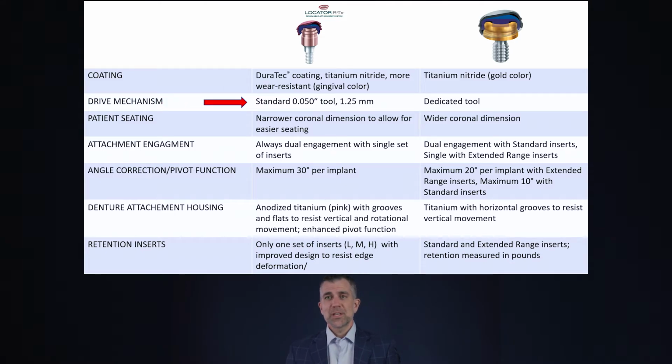The first is that the new locator does not require a custom tool for the particular locator abutment. It requires a standard 0.050 inch driver or a 1.25 millimeter driver.